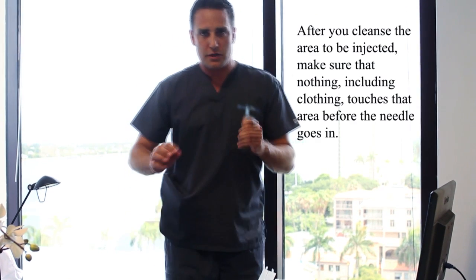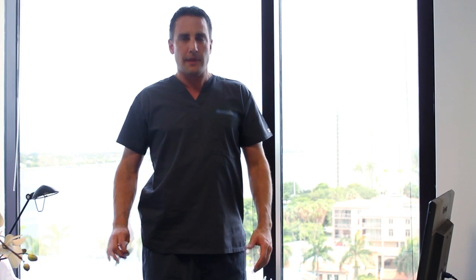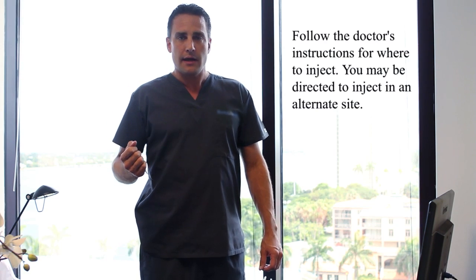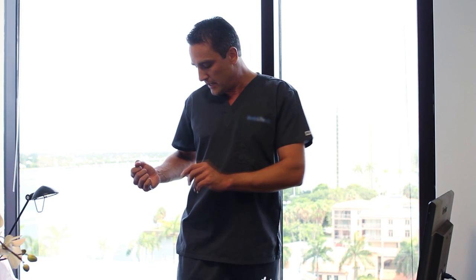Now, when doing the injection, it's a lot easier than it seems. The first thing you want to do is stand with your shoulders squared off to your feet. Now, I'm right-handed, and I'm going to do this injection on the right-hand side because it's easier for me. To reach all the way back there, I'm going to spin the upper half of my body clockwise to my right. And as I turn to my right, all of the weight shifts to my left leg. Why that's important is because now the right leg, or the leg on the same side of your injection, is going to dangle loosely. To make this injection simple, the moral of my story is you want to make sure that you are relaxing the muscle in the buttocks.